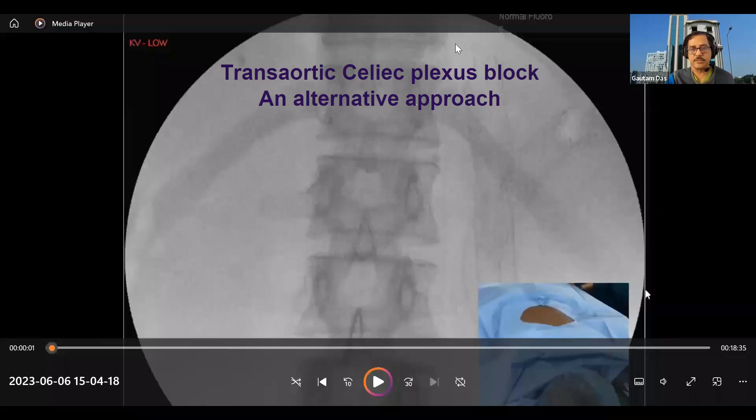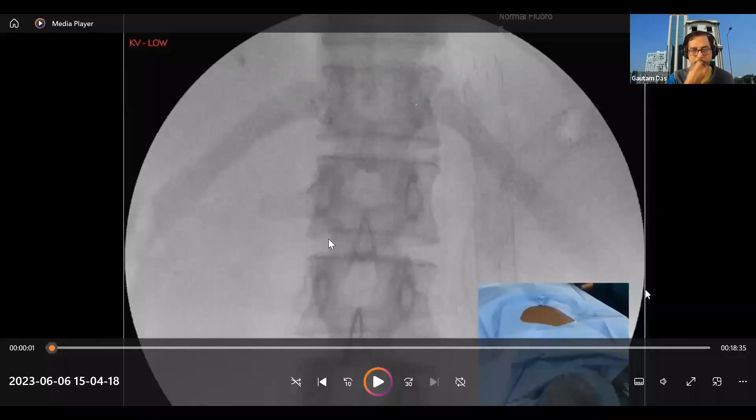I will be showing you this procedure of celiac plexus block. The patient is lying prone. This side is your caudal side and this side is your cranial side.